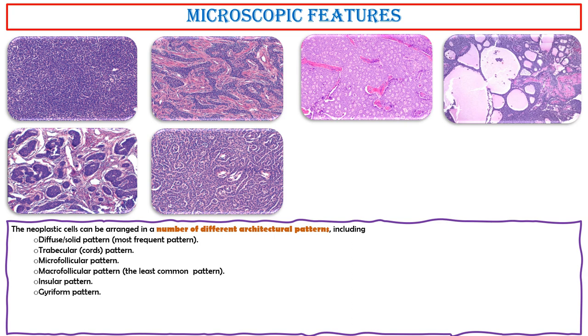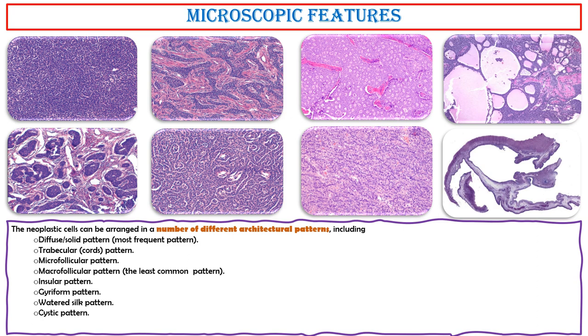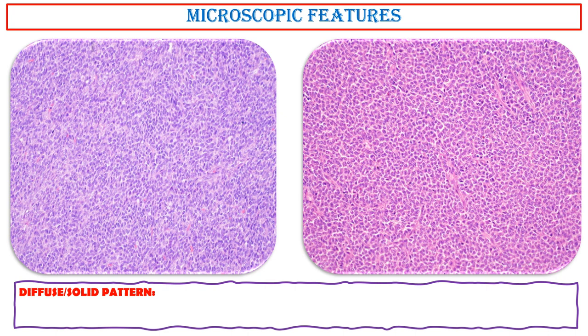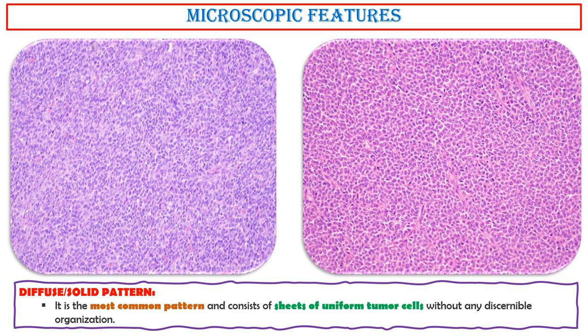Additional patterns include the insular pattern, gyriform pattern, watered silk pattern, and cystic pattern. The diffuse solid pattern is the most common pattern and consists of sheets of uniform tumor cells without any discernible organization.